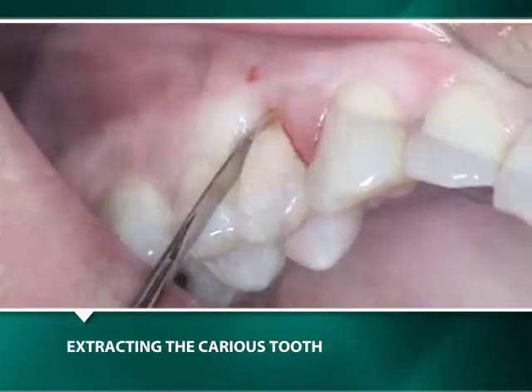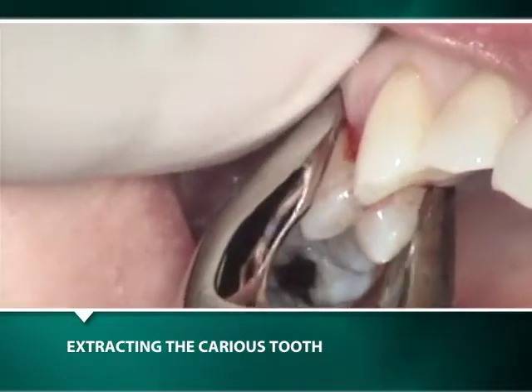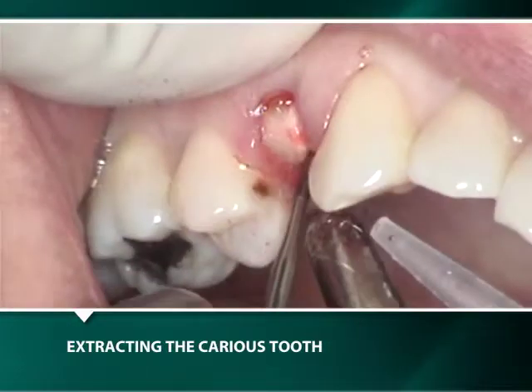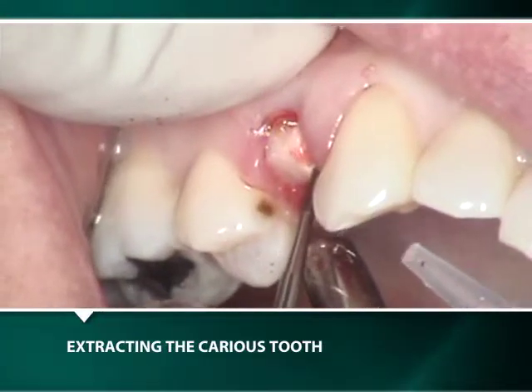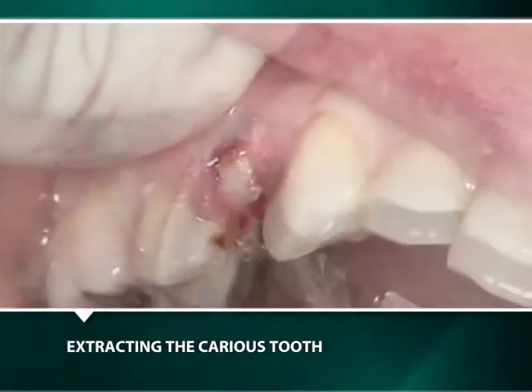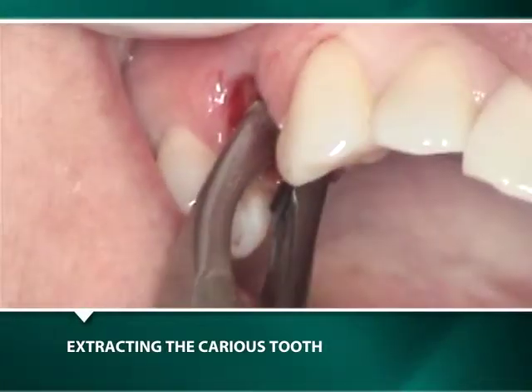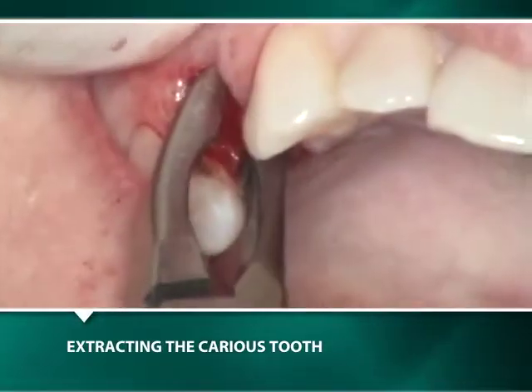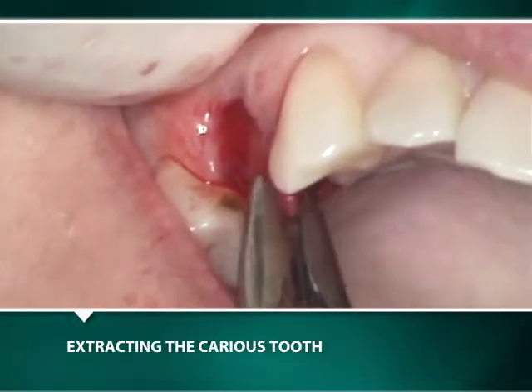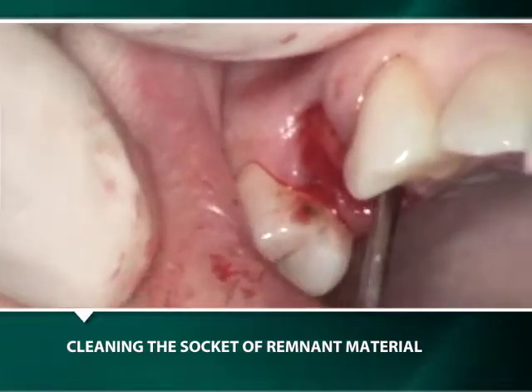Treatment begins with inserting a periotome between the root of the tooth and its bony socket while applying apical pressure with a rocking action. After separating the crown of the tooth from its roots with forceps, the roots are hemisected through their bifurcation with a fissure carbide burr, and the buccal and palatal roots are removed separately. Any granulation tissue or remnants of the periodontal ligament are removed with a spoon curette.